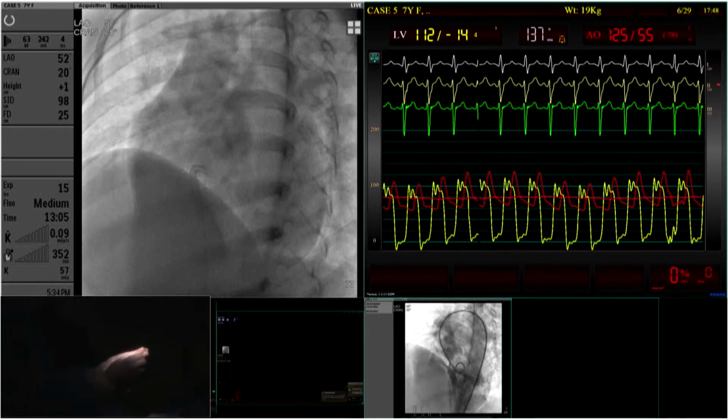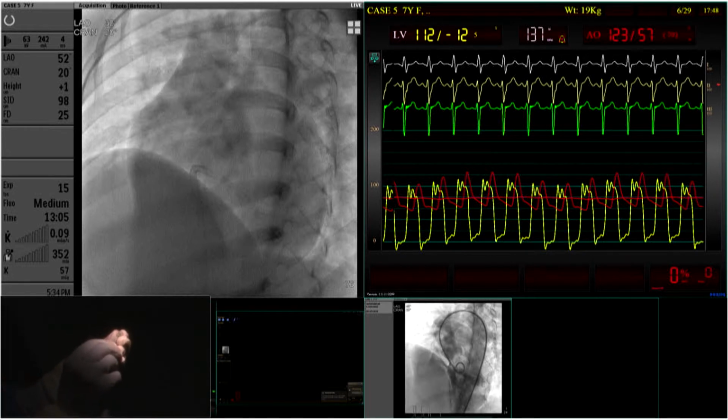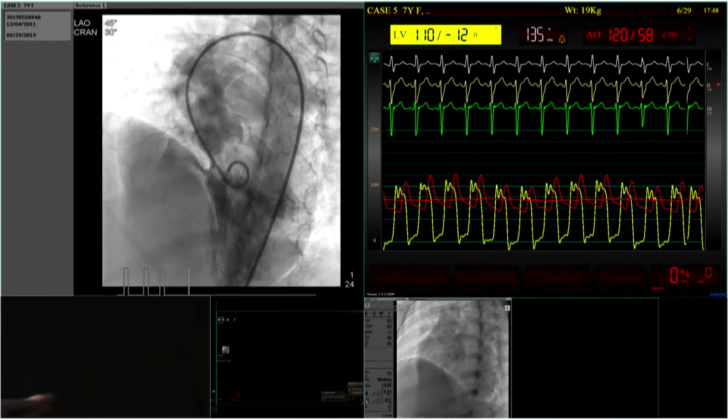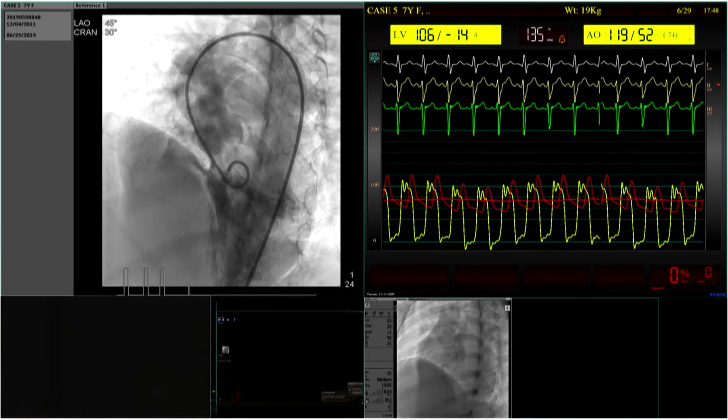If you used an 8-6 Amplatzer device, you would have a smaller left-sided rim. Why did you choose one with 14 when you're so close to the aortic valve, but only 4 millimeters? Sorry, Joe, it is not closer. Can you show the first picture again, this frozen frame, and make it bigger? I think you had at least 4 millimeters, right? Yeah, there is a good amount of gap.